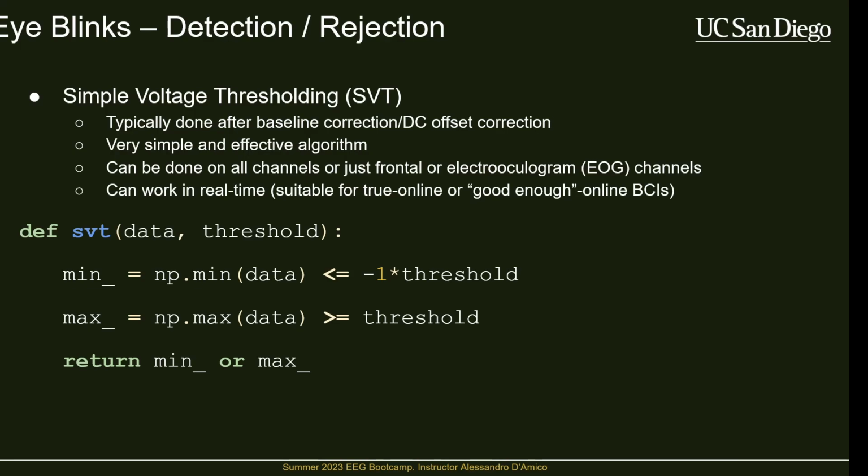And so there's scenarios where if I have a sentence and then I show a subject a word ending that's unexpected, I can only ever record the true response from that one time, because after I show that participant that stimulus, every other time I show that person that stimulus, their activity is going to be more and more attenuated. It's never going to be the same ever as it was that very first time. So in those cases, you have no option.